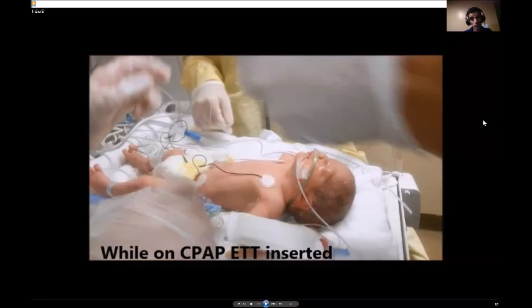We also use two ports: one for insertion of the MAC catheter and the other for ventilation. This means the patient will continue receiving PEEP during ventilation — unlike the open method, where you detach or disconnect the ventilator from the ETT and insert a feeding catheter to give surfactant.